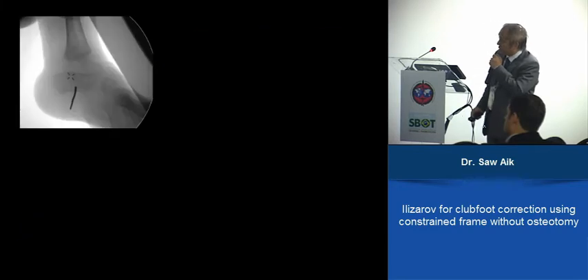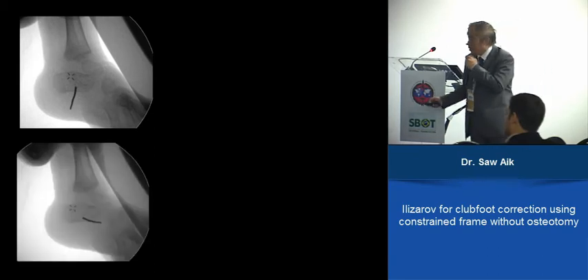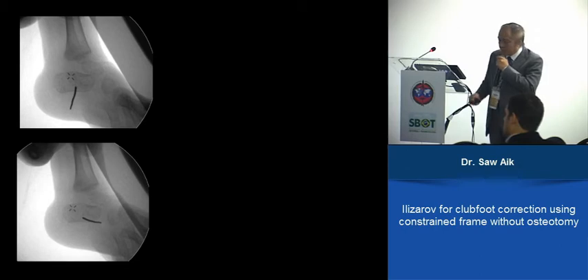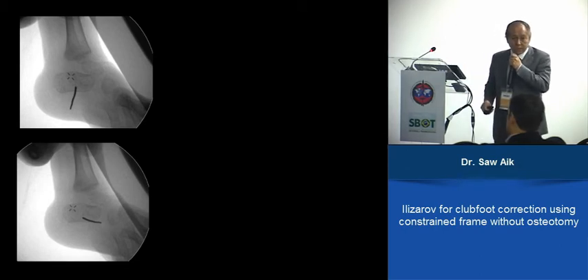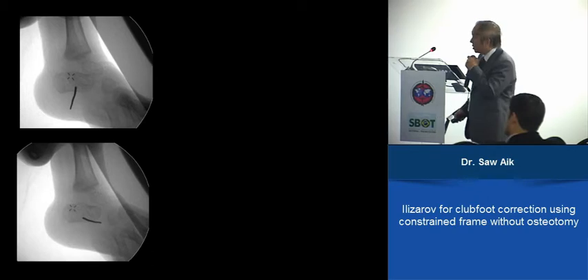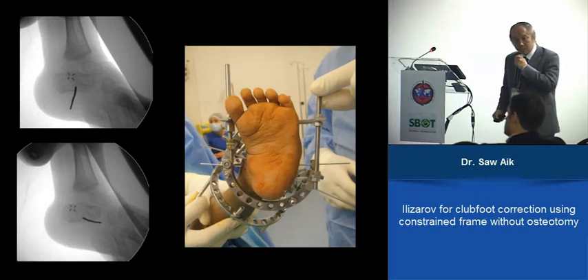Using the same method: the first x-ray image was not clear, but the second wire confirmed placement. Then a ring was placed, and the next wire placed on top of the ring — usually good enough. The hindfoot is put in neutral position, then you go to the metatarsus, then to the tibia.